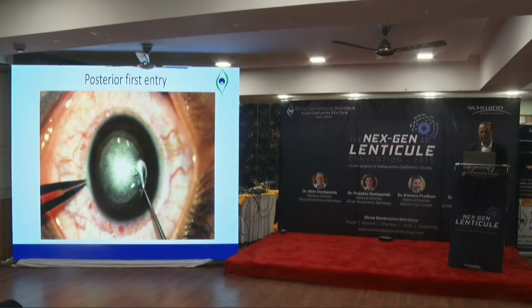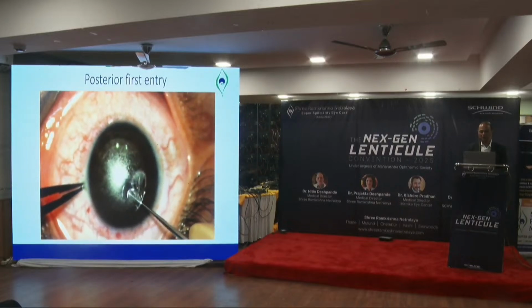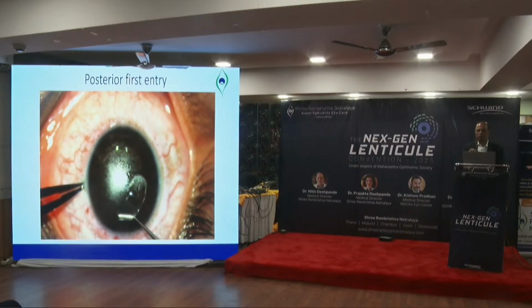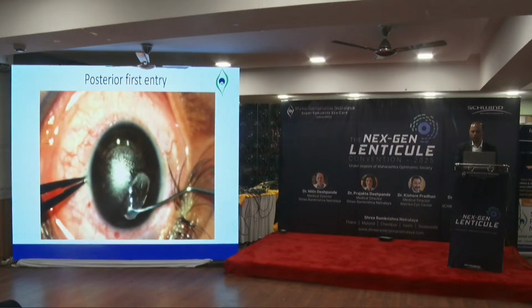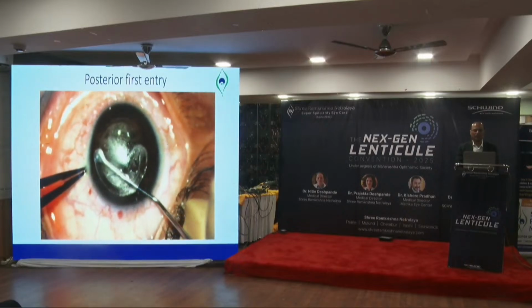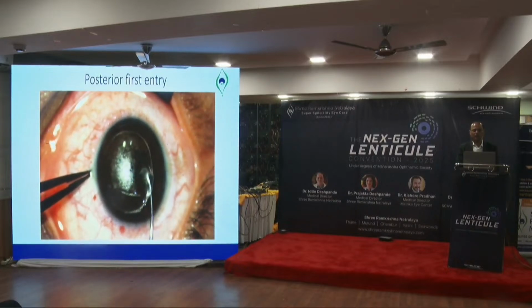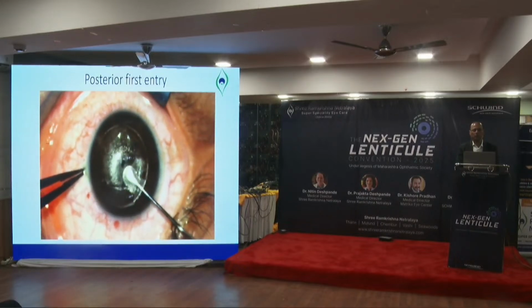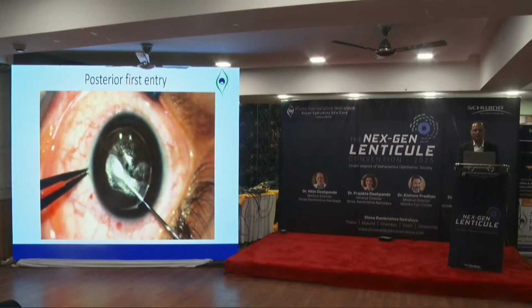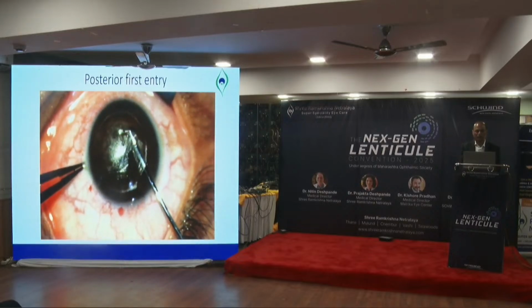Now this is what happens most of the time when you're starting, because it takes a little experience to identify the correct plane. Now you see I'm just going like I'm doing a routine thing. I think I'm anterior, I'm doing a nice sweep around, and now anterior is done, and when I'm going to do posterior, see there is no resistance. I'm just going very smoothly. So now I know that I had gone posterior.